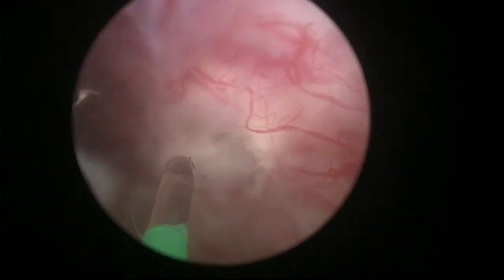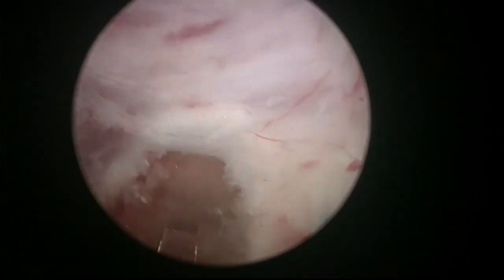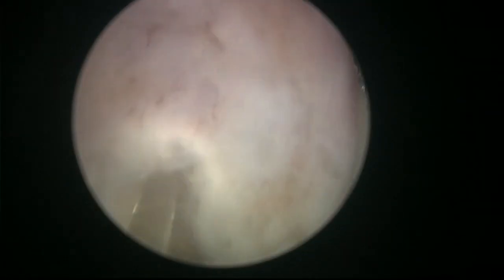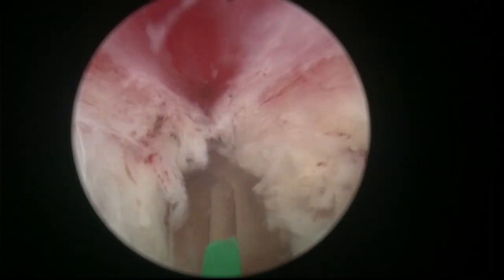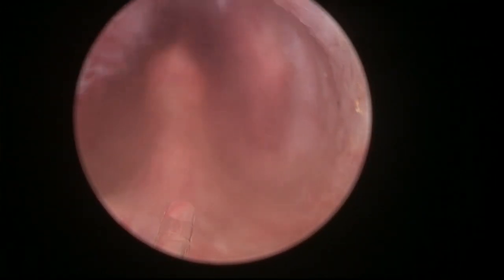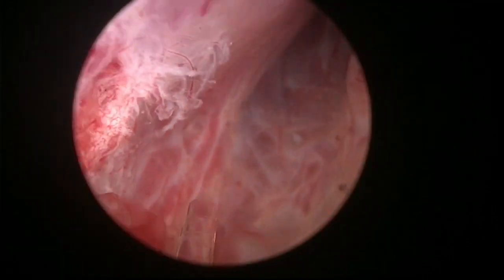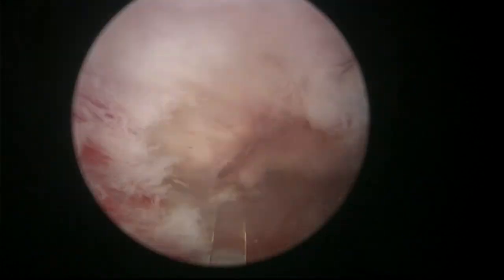We're going to come up to delimitate the white line. And that's the 12 o'clock area. And this is the sphincter. So, despite marking the white line below the verumontanum, it's quite normal in the very large glands that we have to come this far at the apical level.